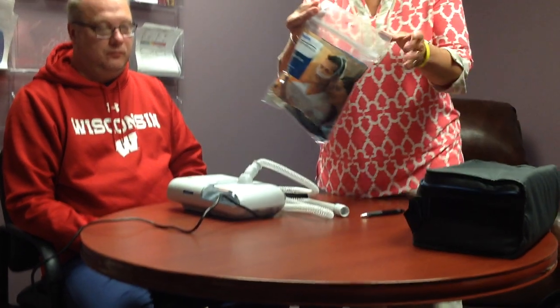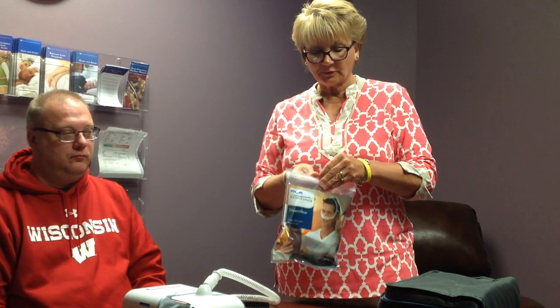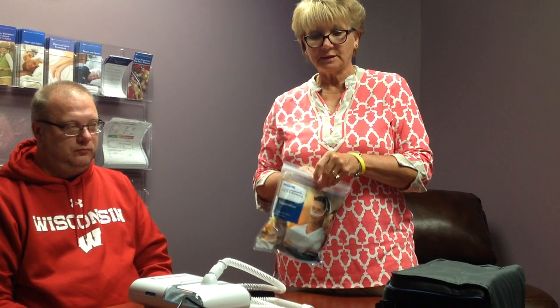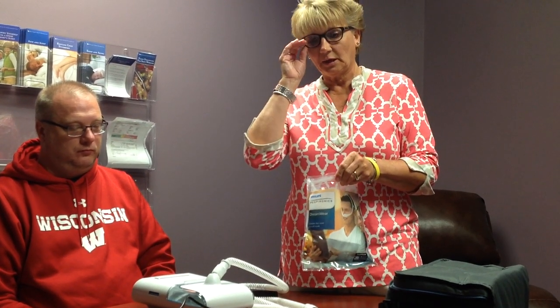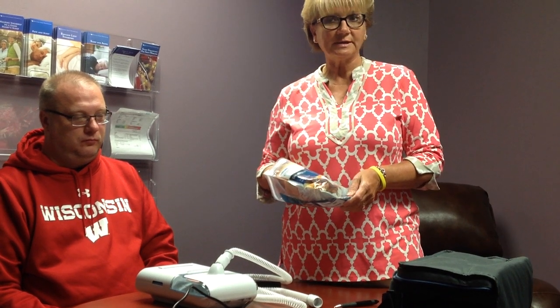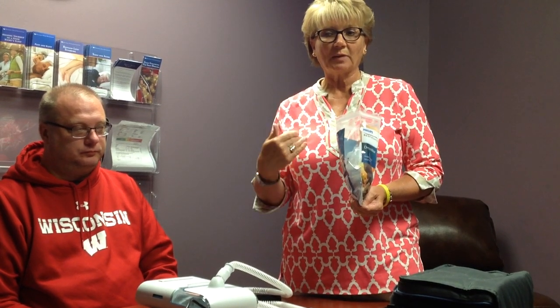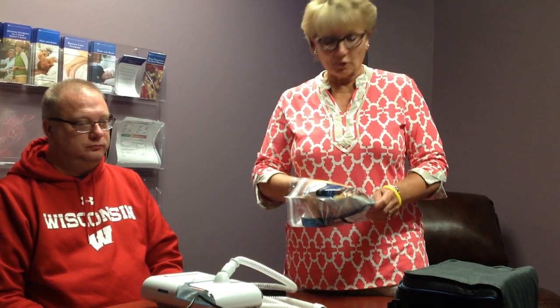Now you're going to open up your mask. We are sending you what is considered a nasal mask — this is for people who breathe through their nose. What we have found is even people who are mouth breathers, with the pressure, it sometimes has the mouth stay shut. So we're going to start out with this. If it is a problem — you feel that you're still snoring, your spouse is still complaining — we can always switch out this mask. We will begin here and then go from there.